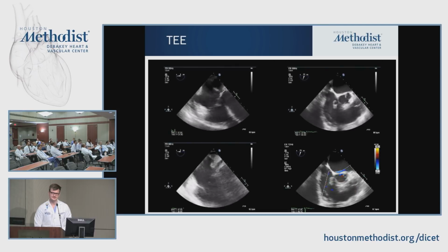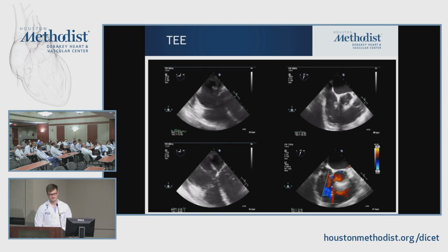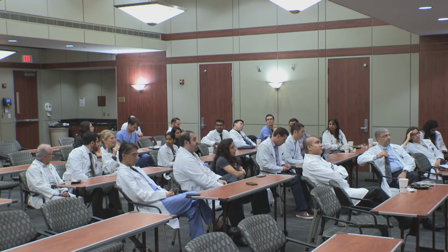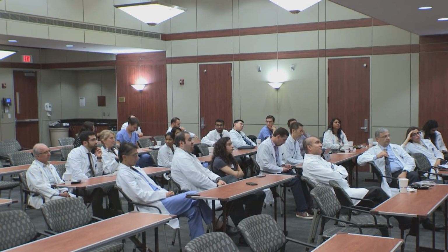We had thought that the jet was due to a quite eccentric TR, and it would fill with contrast if you did it. I guess with the history, you are really concerned that there is a Gerbode defect, though, and you would want to go on to get a CTA to confirm.